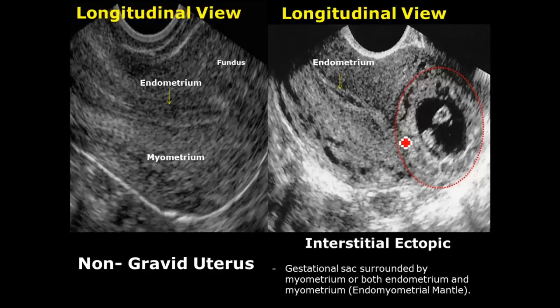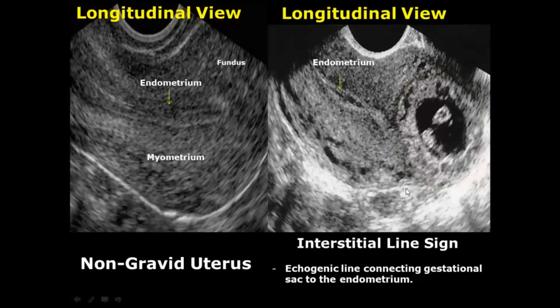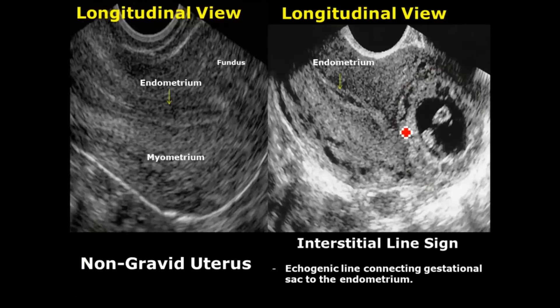The next type is the interstitial ectopic pregnancy, which occurs in the upper uterine horns. The gestational sac is away from the endometrium and is surrounded by myometrium and endometrium — this is called the endomyometrial mantle. One feature of interstitial ectopic is the interstitial line sign: an echogenic line connecting the gestational sac to the endometrium.